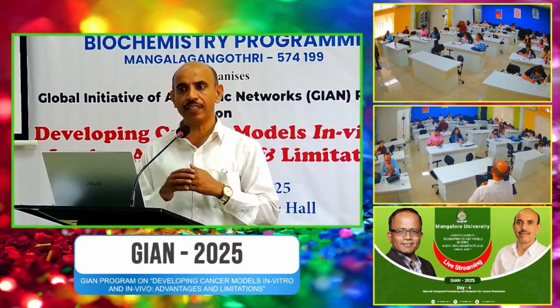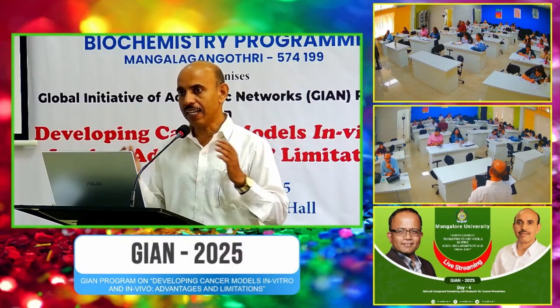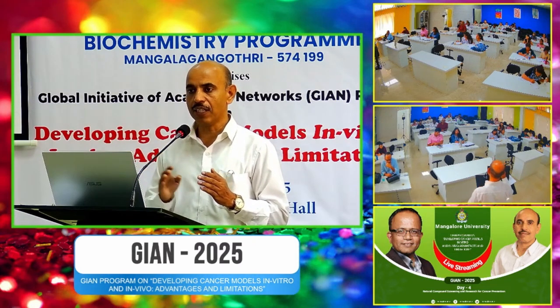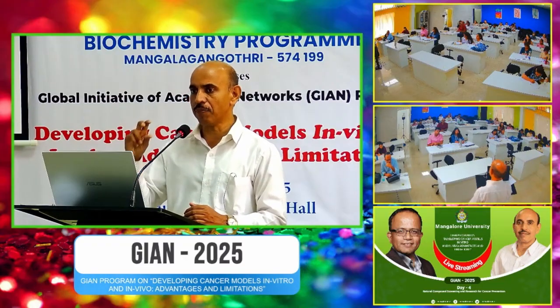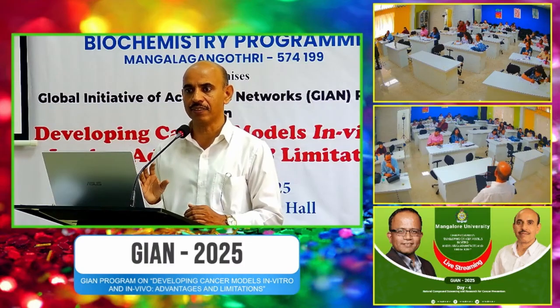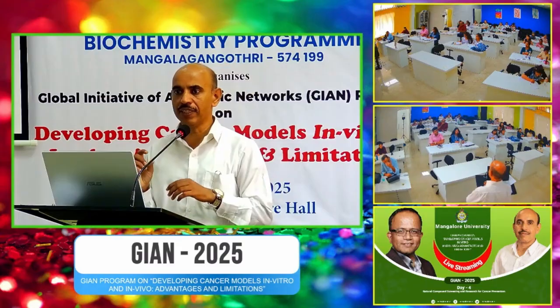That phenol red has a color, and as the pH reduces, that color becomes yellow. If you are getting yellow color or turbidity in the media, you can immediately suspect that something happened in that culture. So you should immediately check for the turbidity as well as the color of the media.